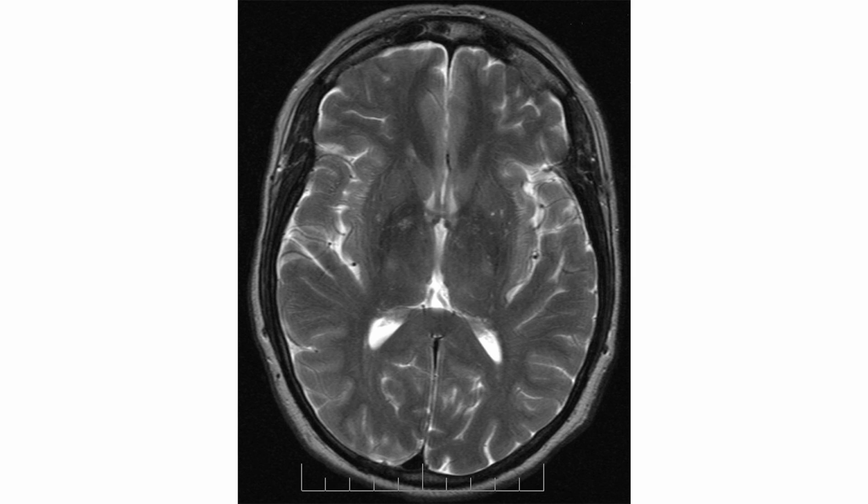In neuroscience, tractography is a 3D modeling technique used to visually represent neural tracts using data collected by diffusion tensor imaging. It uses special techniques of magnetic resonance imaging and computer-based image analysis. The results are presented in 2- and 3-dimensional images.